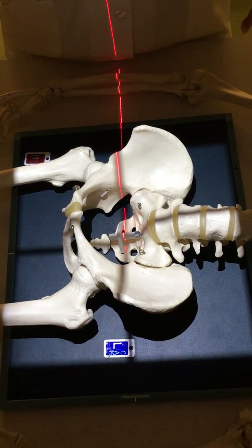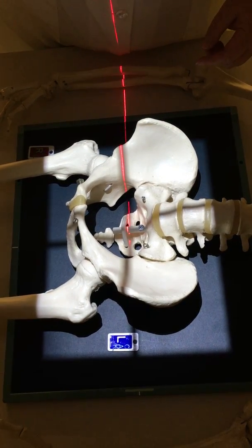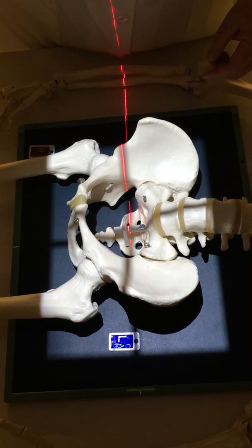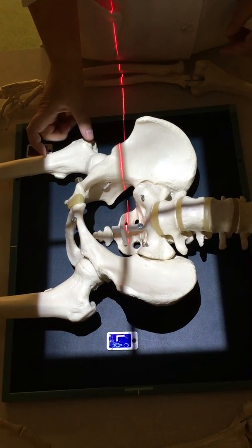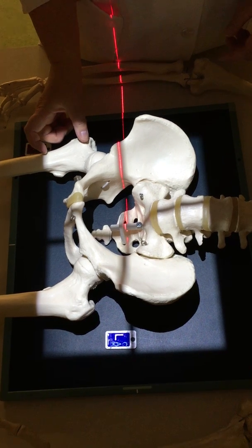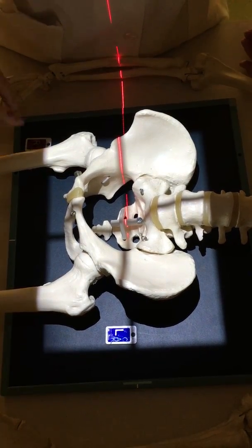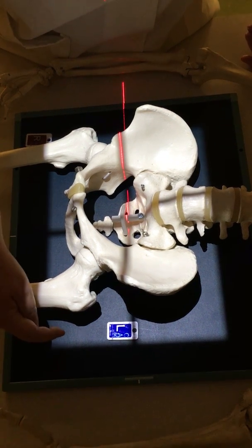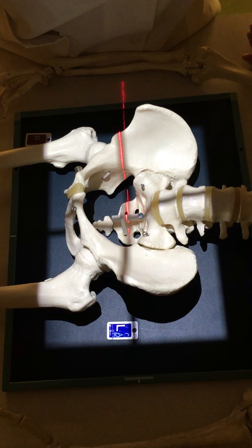Now that I've placed the pelvis in the middle of the IR, I can then collimate down lengthwise so that I still have all of the anatomy of interest. I'm still including at least a quarter of the proximal femur, which is required by Merrell's. As you can see on the left side, my marker placement is easily seen — I did not collimate it off.